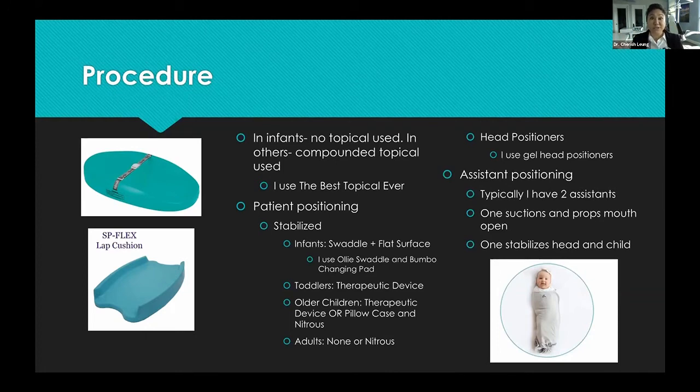As far as head positioners go, like I said, we're looking at the gel head positioners. They have a bunch of different kinds. They have foam. You can get them from a medical supplier like Medline, although at this time it might be kind of difficult.